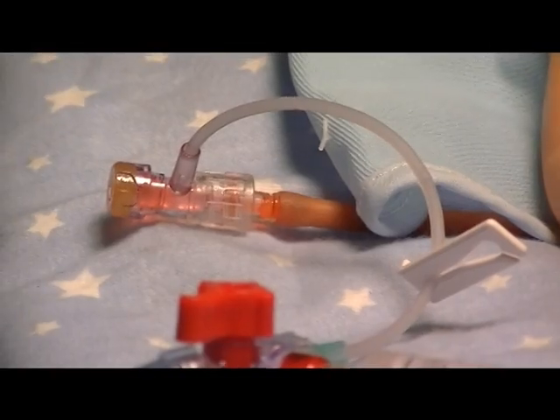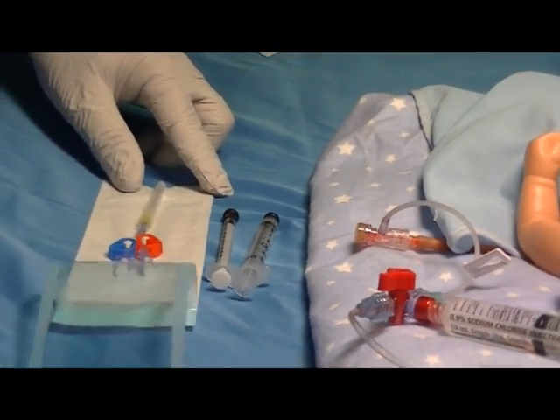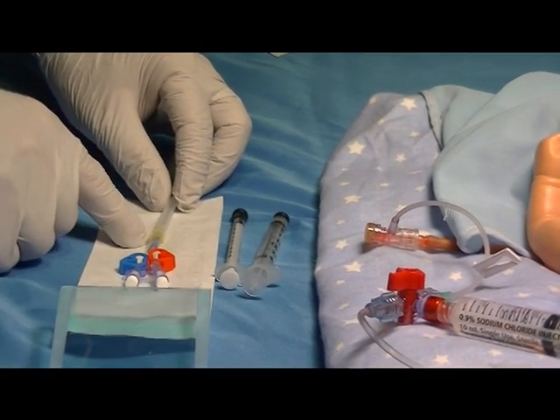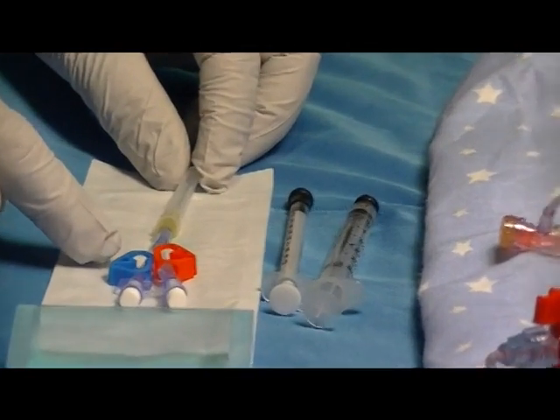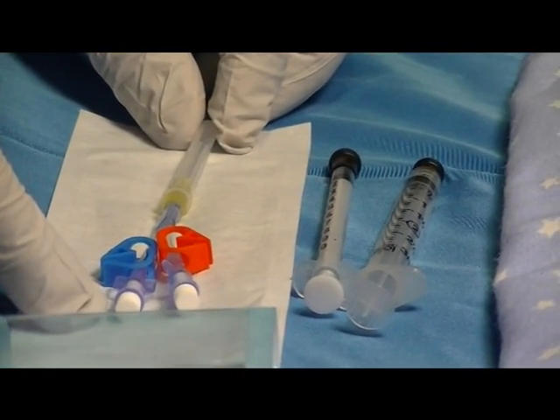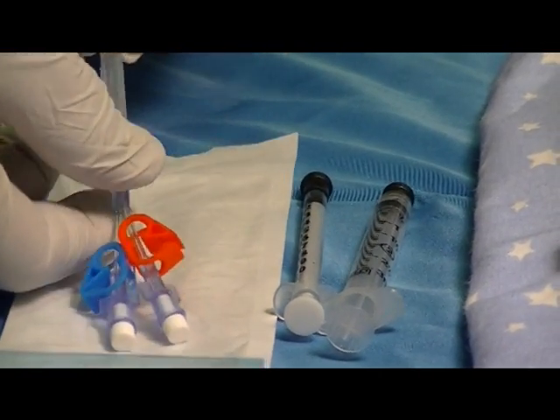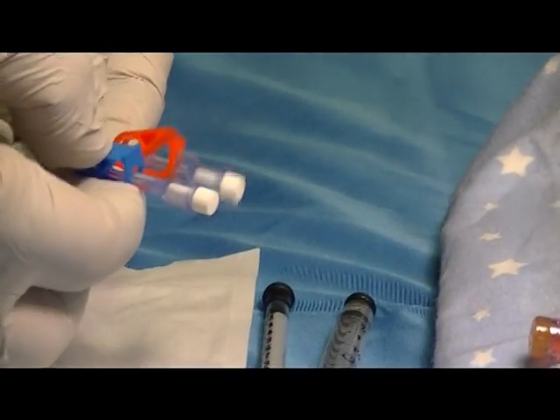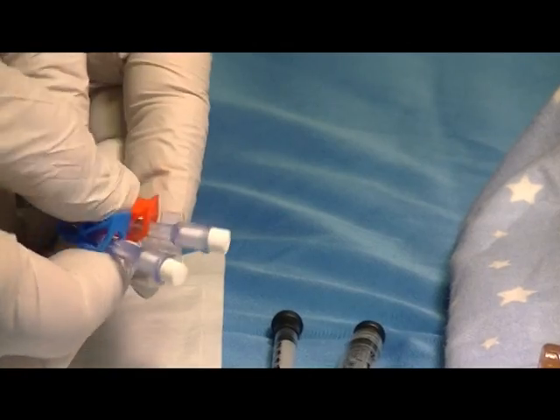Next, go to the Hummey Microdraw device, open it, and inspect it for integrity. Be sure that the sterility cover is on the blunt tube, the red and blue clamps are in place on the lines, and the white vent plugs are also in place. At that point, clamp both the blue clamp and the red clamp onto the lines.